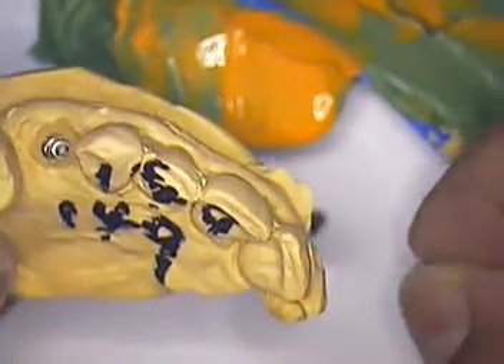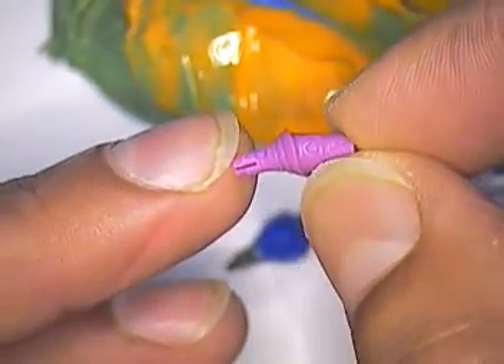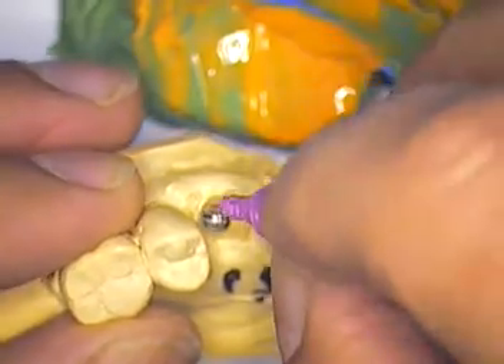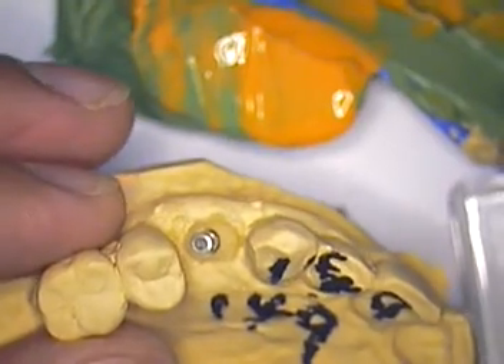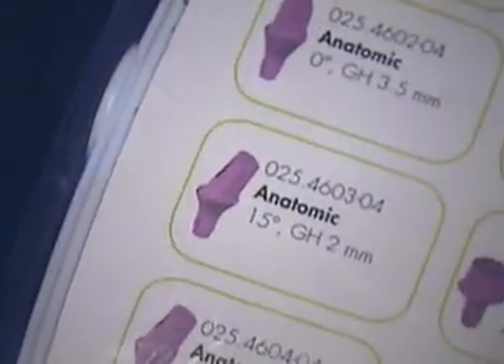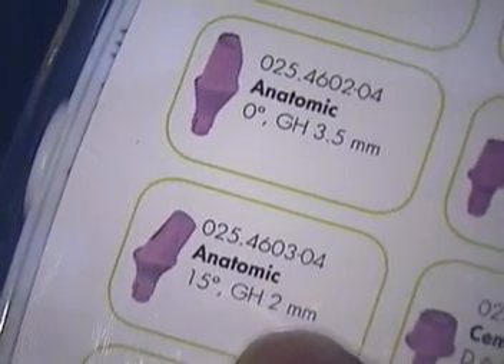For this case, what I would probably do is take a replica of this particular item that you can purchase, put it in place, and go ahead and prep the design and the margins the way you would want them. Let me show you where we select those copings from. This one happens to be from Straumann. This is the box, and that particular item is 025.4603-04.